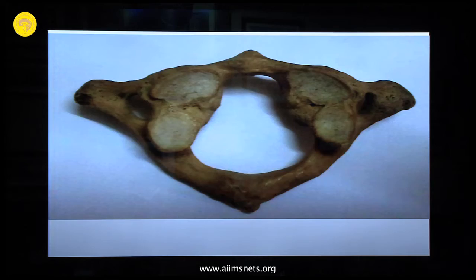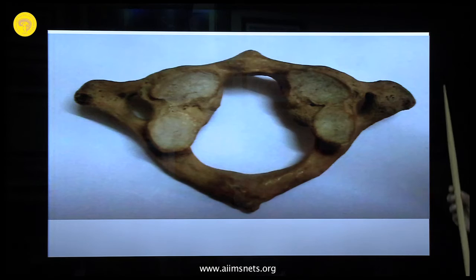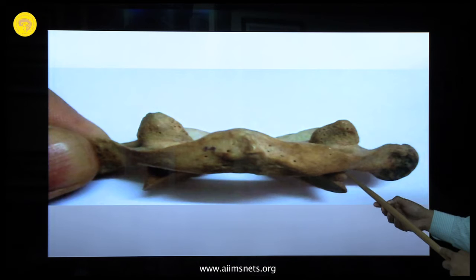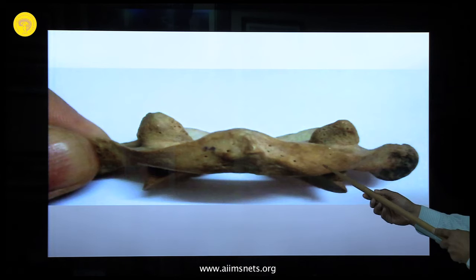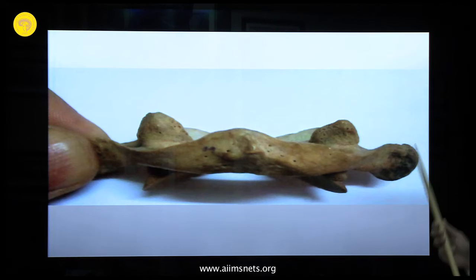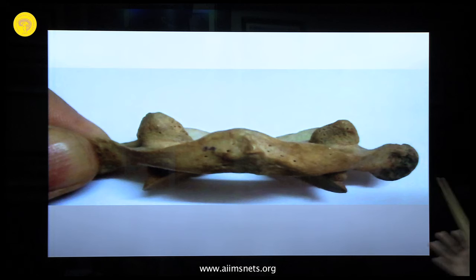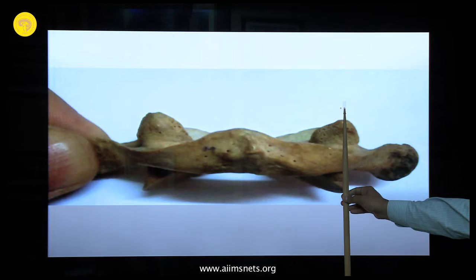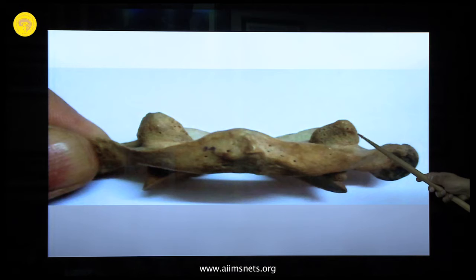You will never injure the vertebral artery with this trajectory — it is always lateral in the foramen transversarium. When viewing the posterior part, you only get the inferior articular process. You can drill a little of the posterior arch safely. When dissecting C1, never dissect along the superior border and never go beyond the lateral margin of the lateral mass. There is no need to expose the upper margin of C1.